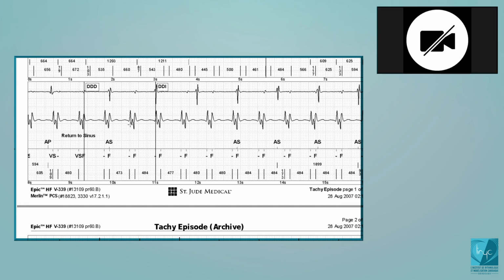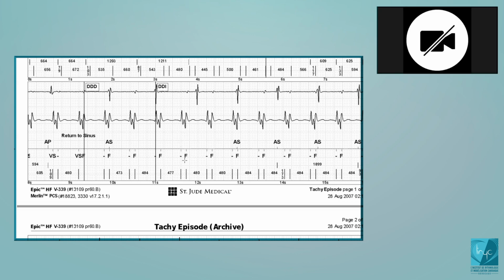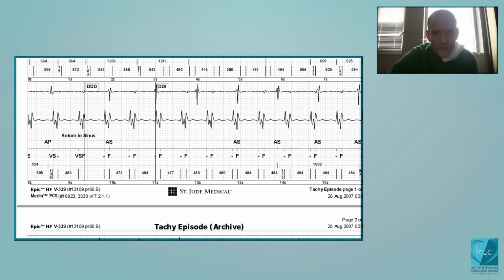Is this a parameter that you can program? We can program it. 125 or 157. Yes, for Abbott, this is a parameter that you can program. You have two choices: 125, that's the case here, or 157.